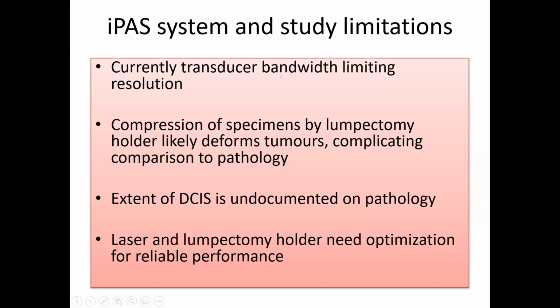So this study established a few significant limitations of our current system. Specifically, our system is unable to visualize surgical aids, which is a big standard for current surgical intraoperative imaging, as we tend to use it to confirm the presence of radioactive localization seeds, as well as the position of other surgical aids such as tissue clips and guide wires.